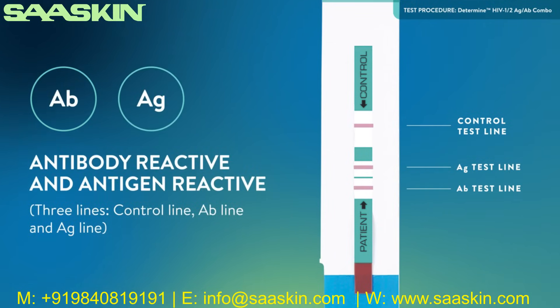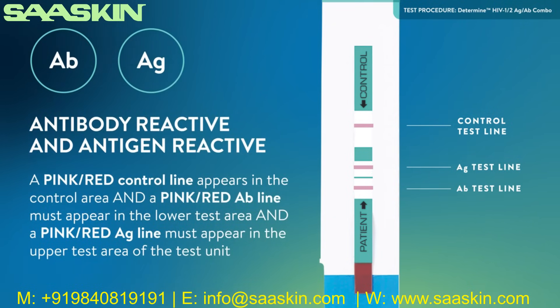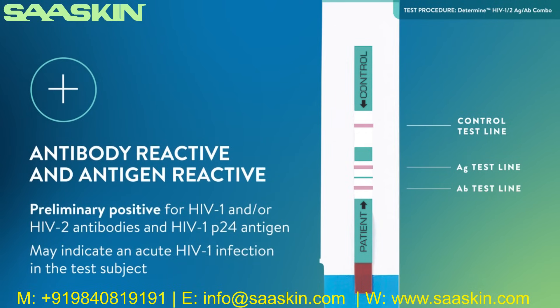Antibody reactive and antigen reactive result — three lines: control, antibody, and antigen lines. A pink-red control line appears in the control area, a pink-red antibody line in the lower test area, and a pink-red antigen line in the upper test area of the test unit. The intensity of the control, antibody, and antigen lines may vary. Any visible pink-red color in the control area, lower test area, and upper test area, regardless of intensity, is considered reactive. The test result is interpreted as preliminary positive for HIV-1 and/or HIV-2 antibodies and HIV-1 P24 antigen.